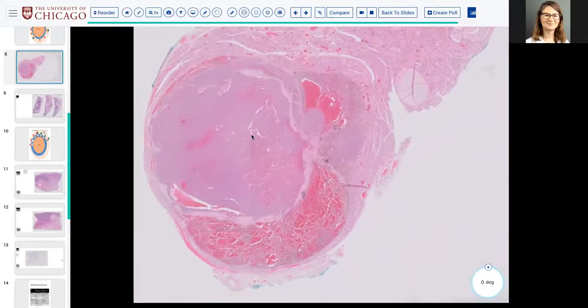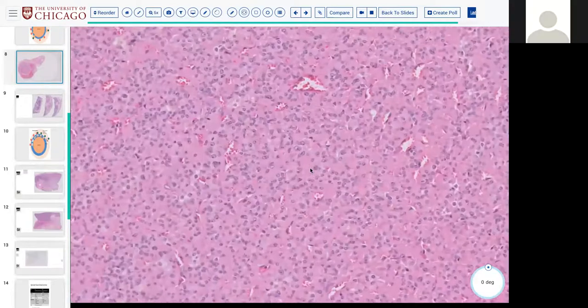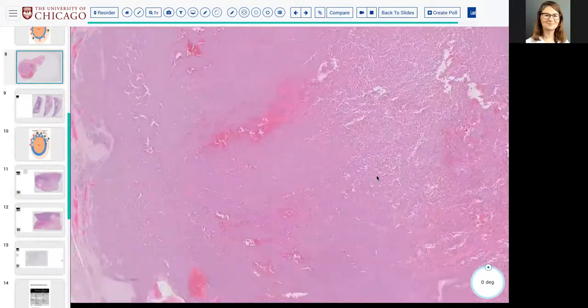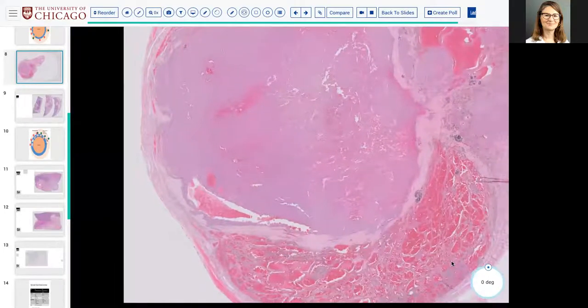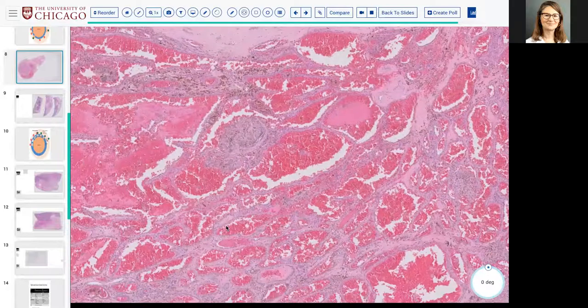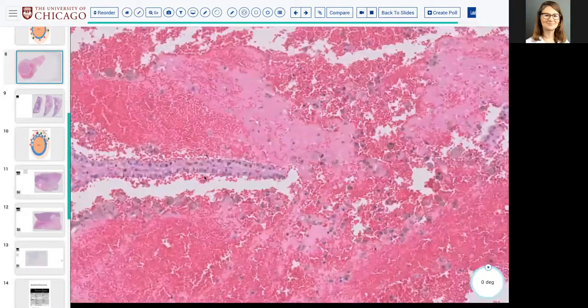So Hürthle cell lesion with blood, with fibrosis and hemosiderin, and Riham is saying question mark infarction. And then there are these lakes with, as you pointed out, arguably some weird pokey looking papillae.